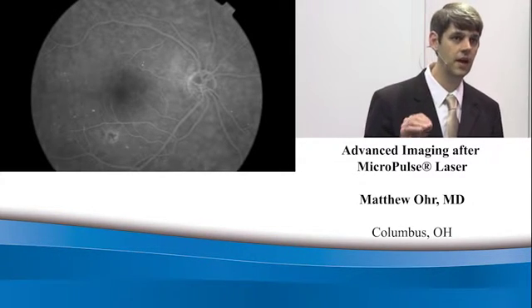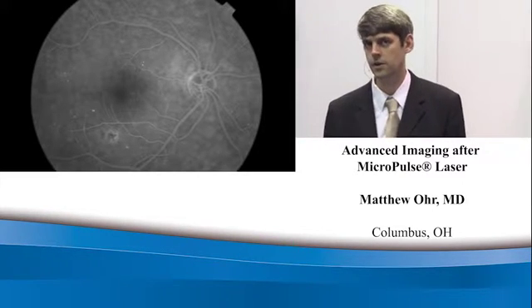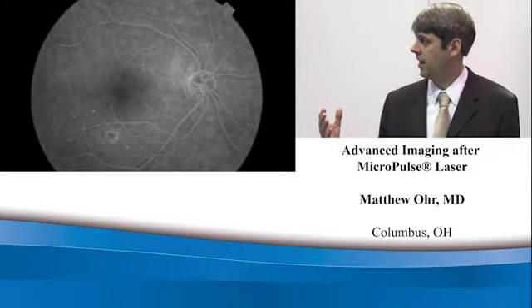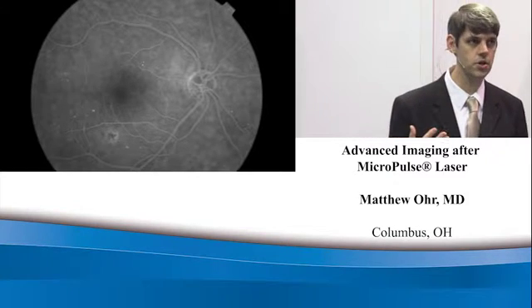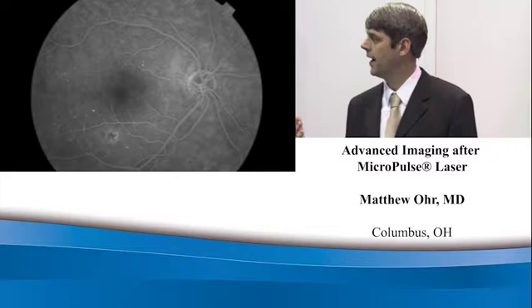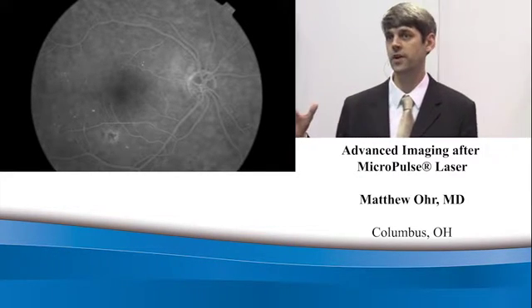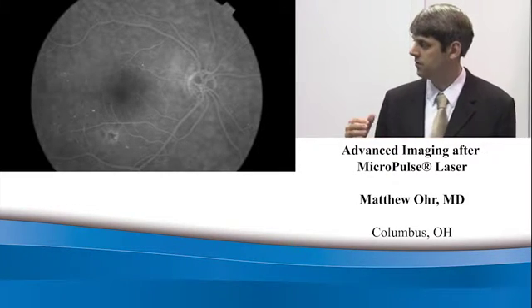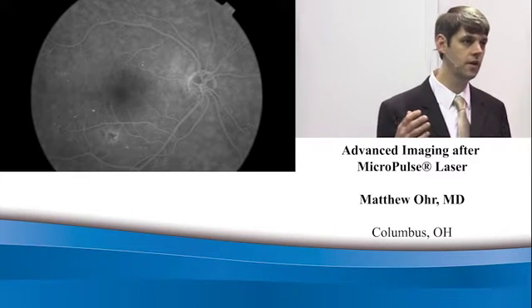And for me, at least starting out, we've had the Iridex laser now with the MicroPulse technology for about 2 years at our institution. One of the things that I looked for when I was first starting out with MicroPulse is who are the patients I'm going to treat, right? We have anti-VEGF therapy, we know that works for center-involving edema, and at least the way I practice is, we do a lot of focal laser for patients that have edema outside of the macula, because those are the patients who tend to benefit the most from focal laser without the concern for the vision changes.